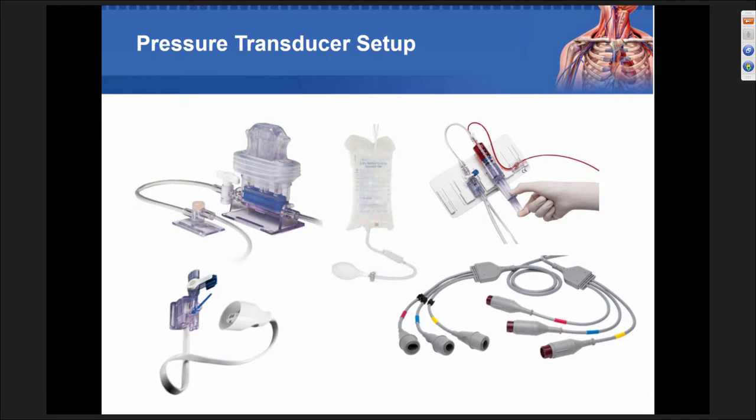So these are examples of your pressure transducer. And I'm going to talk about these throughout the presentation. So I just wanted to make sure that you knew exactly what I was talking about. So up on the top corner where it looks like there's a plunger apparatus, that's called a vamp setup. And what a vamp does, it allows you to aspirate waste into a closed chamber. When you aspirate waste into a closed chamber, this is required anytime you do a blood sample. Then what happens is you remove the blood sample after turning the waste chamber to the off position and aspirate out of the little plunger, the little yellow plunger there that's just distal to the waste chamber.